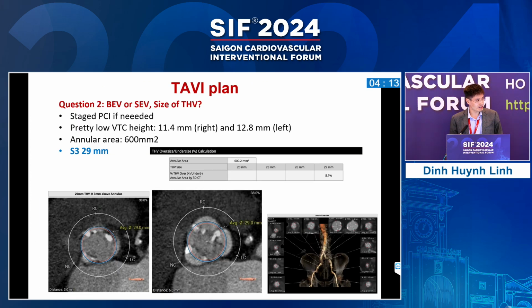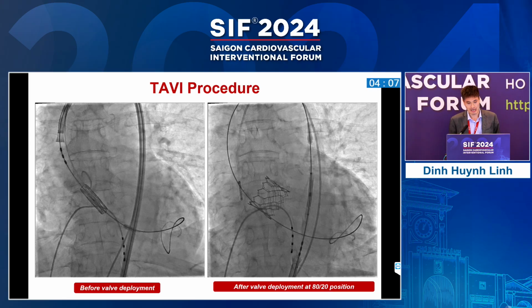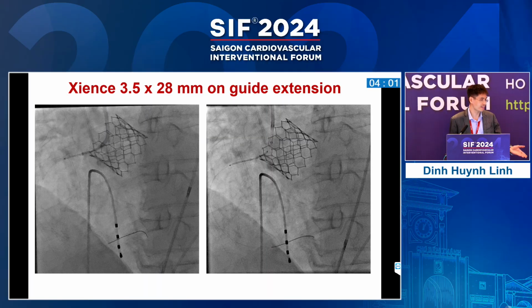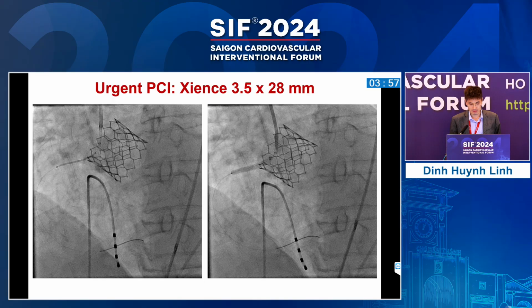Okay, so we did the TEE. Yes, because the patient is already intubated, so we did the TEE. Because of course there could be, but if it's partial annular rupture, then that could be okay. Then some effusion. Yeah. That is very true. It looks like it got into the right atrium. Yeah, it's going into a kind of cavity which we don't know what it is.